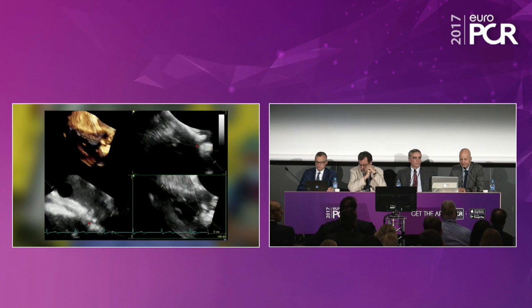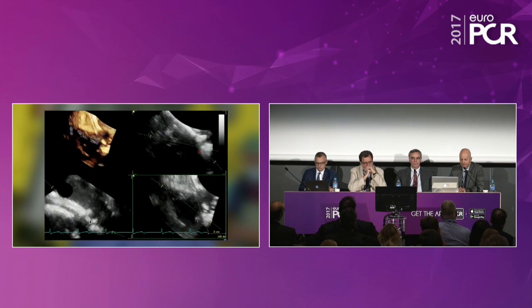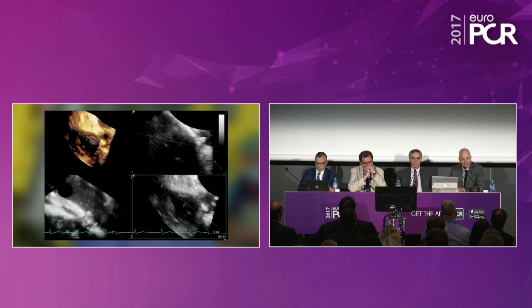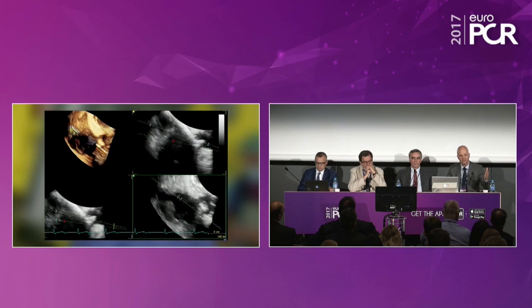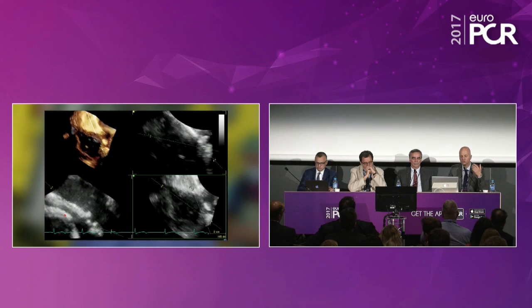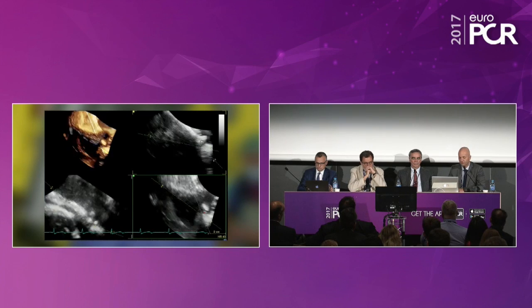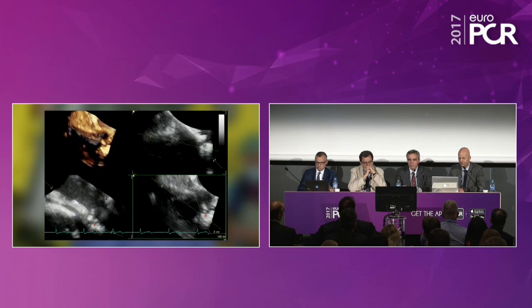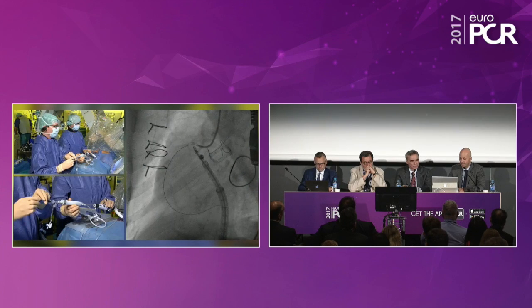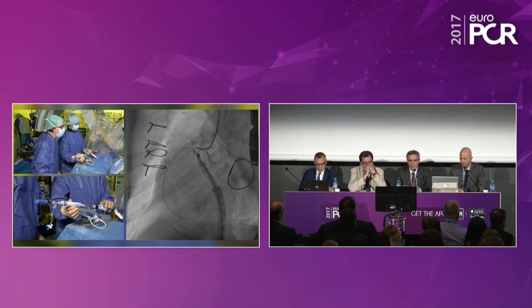You can locate the catheter on the hinge point. This is very important, that you don't drive the anchors into the leaflet. And on the other hand, you can see on fluoroscopy that the anchor is not too close to the right coronary artery. You can also visualize the right coronary artery to some extent by echocardiography, but I would never rely on this. So here there is the first anchor, and you can see it is screwed in.